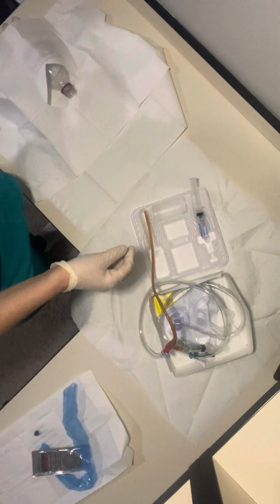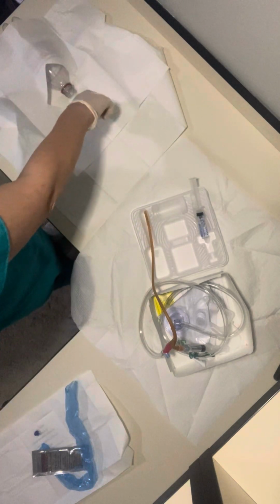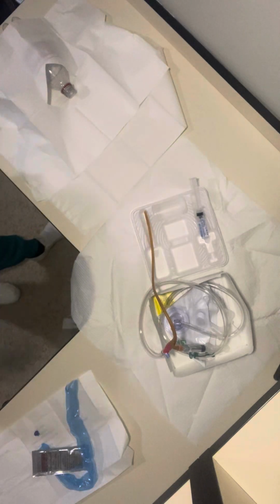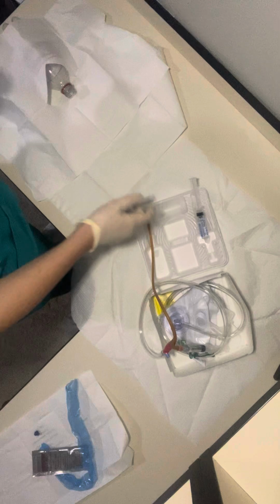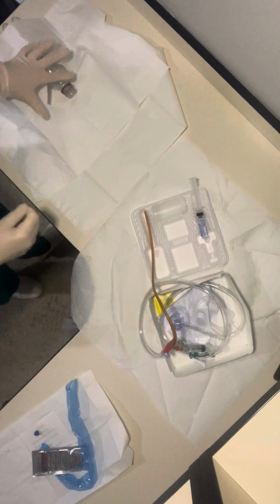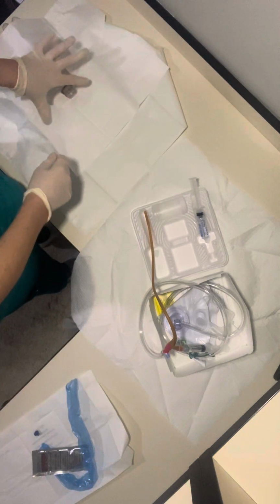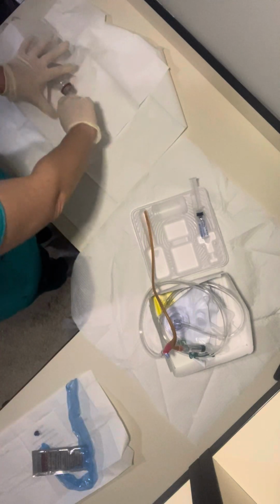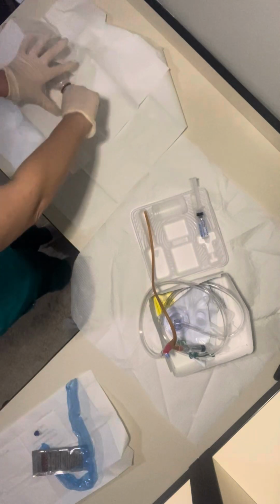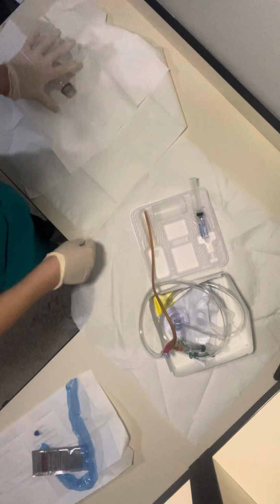Okay, so first to clean, I would take one swab. You do labia majora, labia minora, and then I would go out, labia minora, one swipe. So each swab is one swipe, and it would go straight down just like we cleaned. And then the meatus, which would be straight down, okay? And so at this time, I will touch the patient to continue to hold open the areas that I just cleaned. So I would hold it open, swipe down, step out and around, swipe down, step out and around, swipe down.